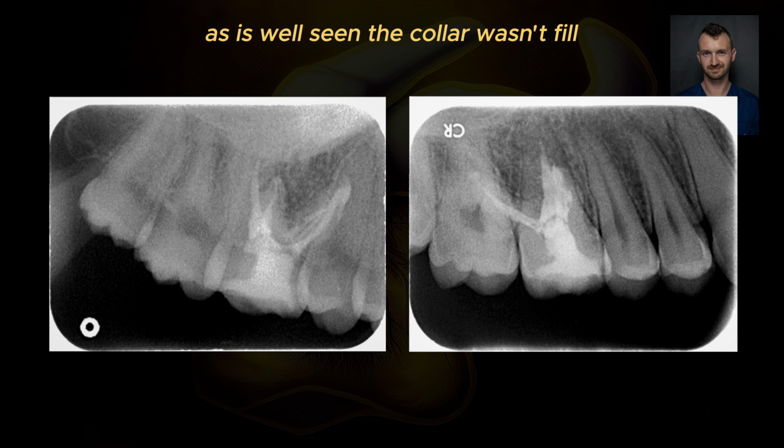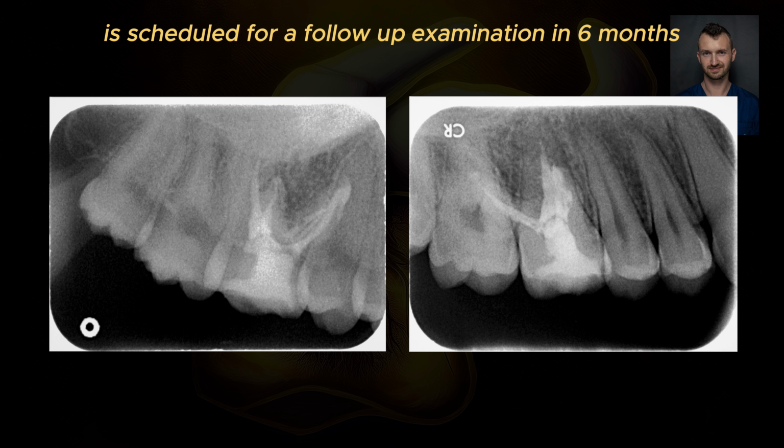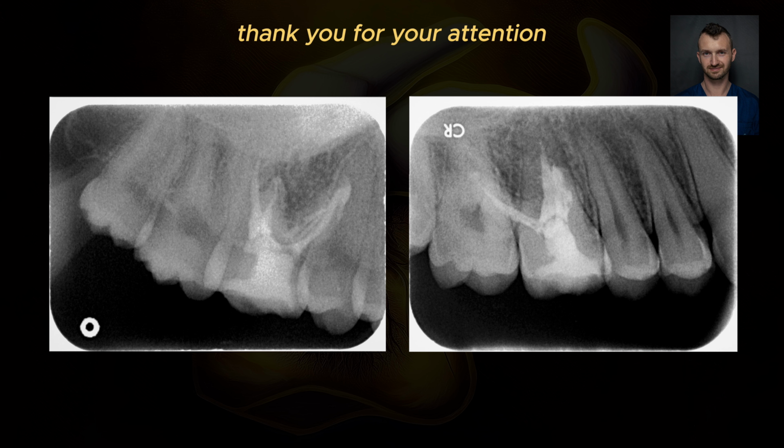As is well seen, the sealer didn't fill the whole complex formation. The patient is scheduled for a follow-up examination in 6 months.